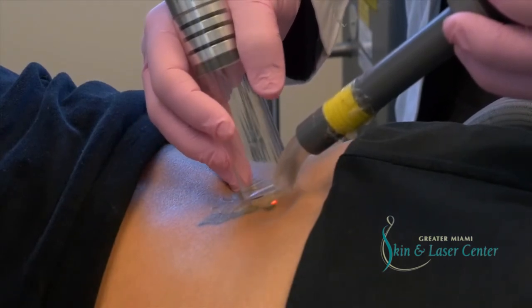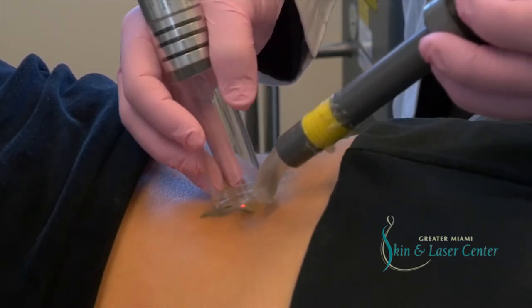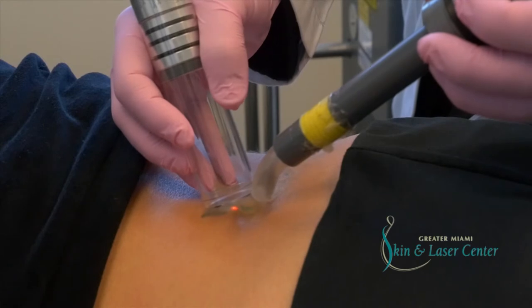How is it? It feels okay now? Yeah. The worst is right when you're doing the procedure. After that, you might be a little sensitive, a little sore.